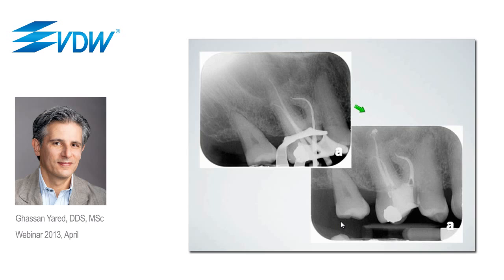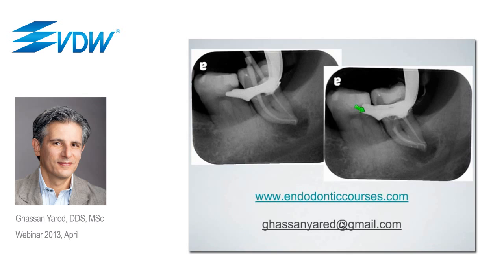And it's not only about one case. It is about a second case where the reciproc instrument was used here without any prior hand filing, without creating a glide path. It's not only about a second case, it's about many cases that are done exactly in the same manner in a reproducible way. Imagine an R25 going to length in this sharp apical curvature without, in this case, fortunately for me, without the need to use hand files and without the need to create a glide path.